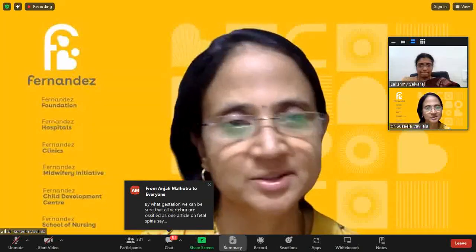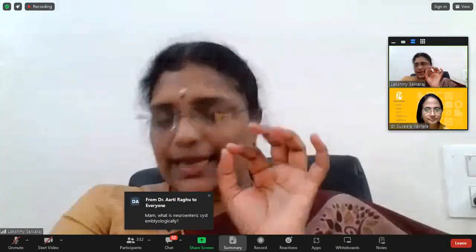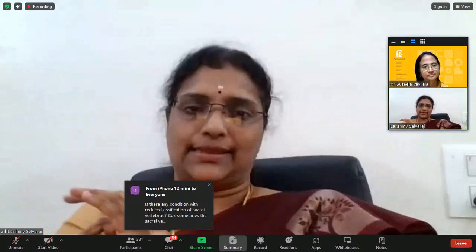For practice purposes, you can do it, but routinely, conus distance, we do not document as well. On a routine scan, we just look at the conus and stop with it. Only if you have a spinal abnormality do you do the entire exercise.